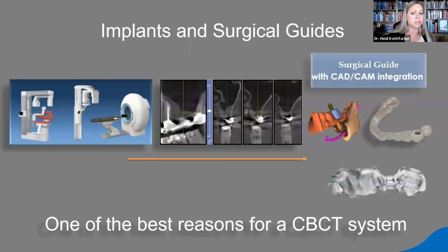And that was with dental students. So obviously with a clinician, we know that it's going to be a lot higher. So very, very just amazing. I don't think I would place an implant, especially if you're first starting, without a surgical guide.